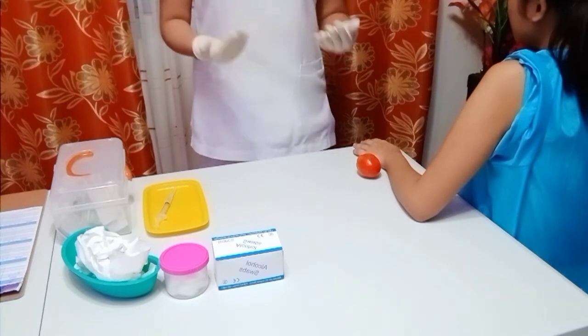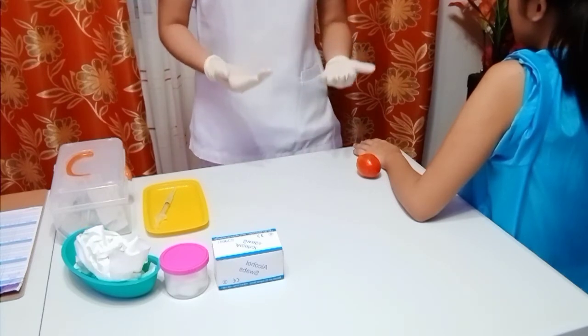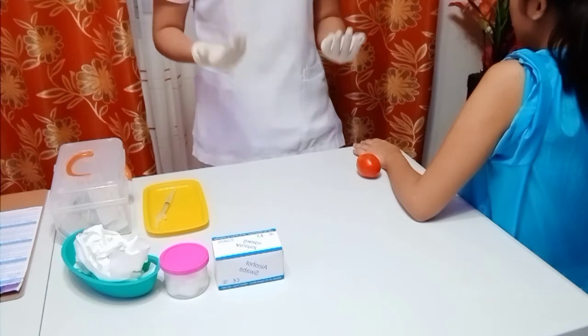Gloves protect both the nurse and the client from possible transmission of microorganisms.